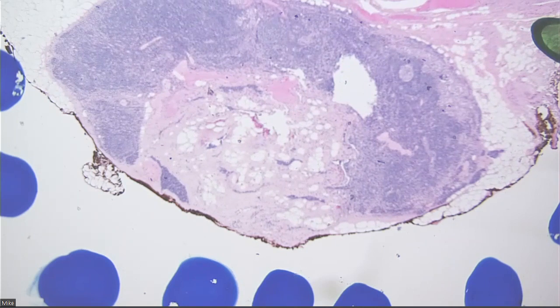And that's also important when you're getting these neck dissections to measure grossly the largest size of the largest lymph node that you see, especially if it's grossly involved, because sometimes when you cut it up, we histologically lose the greatest dimension, right? Because if you're cutting it against the longest dimension, we can't recreate that measurement on the slide. You have to give it to us in the gross. So I really do pay attention to the sizes of those lymph node mets that you give me from the gross description, because if the tumor is filling the lymph node and you've given me that gross measurement, I will use that as the largest size, and that will help determine what this patient needs.